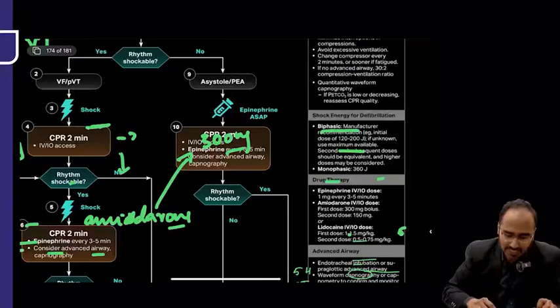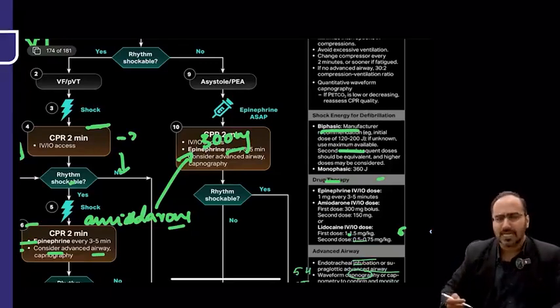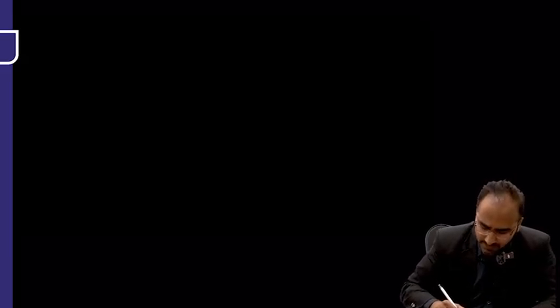Now guys, imagine in the second step, you kept the defibrillator, you are looking for the rhythm, and now you don't get that rhythm. What rhythm do you get, guys? You get this kind of rhythm.